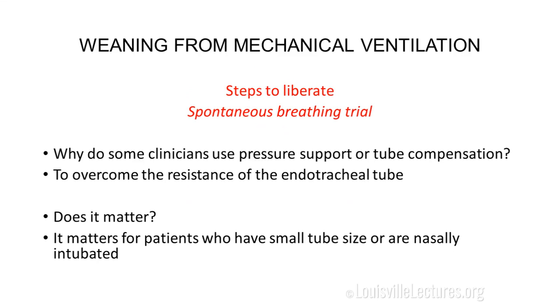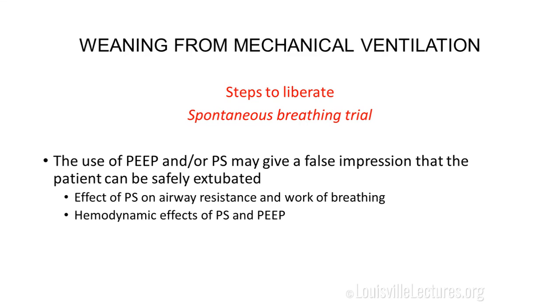So, a little bit of physiology. Why do some clinicians use pressure support or tube compensation? The idea is to overcome the resistance of the endotracheal tube. And does that matter? It matters in patients who have a small tube size or are nasally intubated. But you should also realize that the use of PEEP and pressure support may give a false impression that the patient can be safely extubated. And that has to do with the effect of pressure support on airway resistance and work of breathing. It also has to do with the hemodynamic effects of pressure support and PEEP.